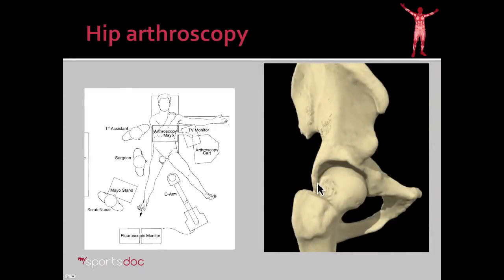Here you can see, as we've put traction on the hip, we've created a little space to get in there. We can then insert a 5mm camera as well as a 5mm instrument and begin working inside the hip without ever dislocating it. This is done through two 1cm incisions.